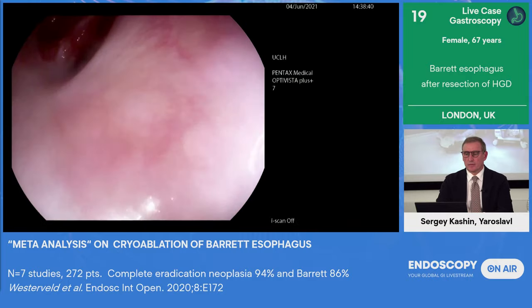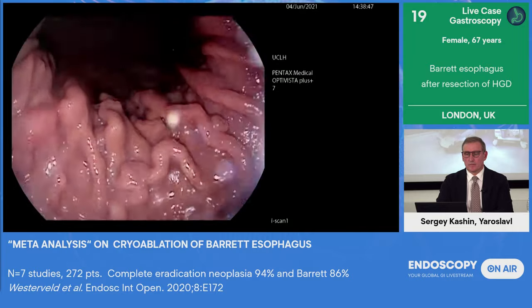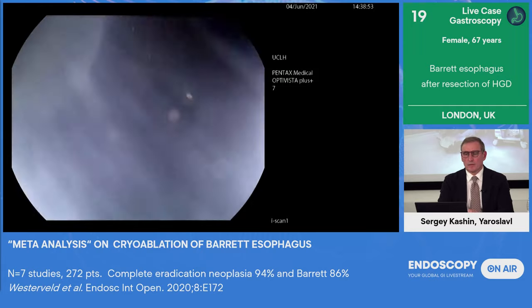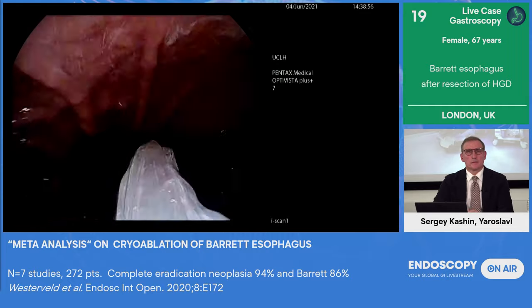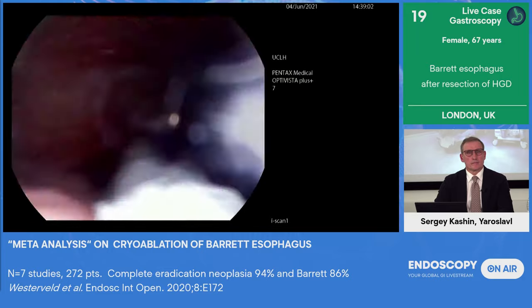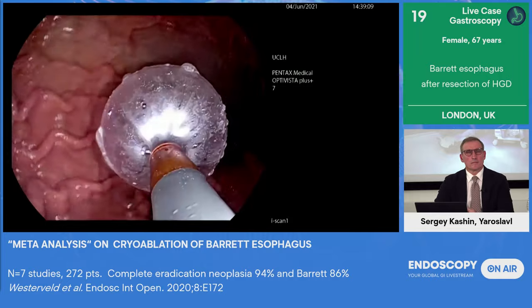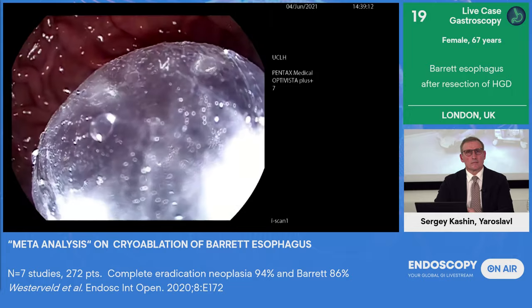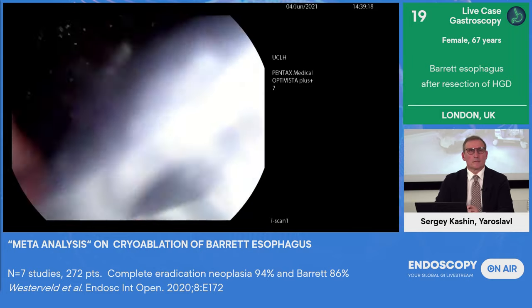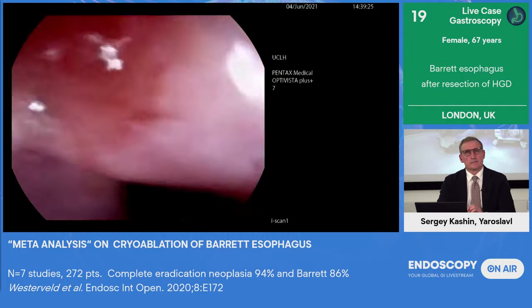So what we're going to demonstrate to you here, ladies and gentlemen, is the use of the pear-shaped balloon. And so this goes down the working channel of the endoscope. I have a foot pedal here at my right foot, which is going to allow me to do everything that I need to do. So you'll begin to see there is the pear-shaped balloon. And what I'm going to do is blow it up for you in the stomach so I can demonstrate to you what it looks like compared to the straight balloon. So you can see that it has a bigger proximal end, and it just cones down at the bottom end. And that's beneficial for these types of esophaguses where you basically have a lot of asymmetry and scarring.